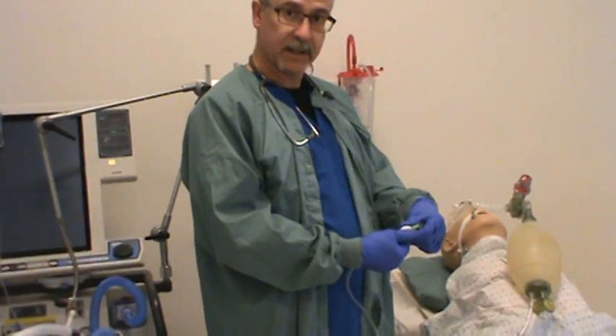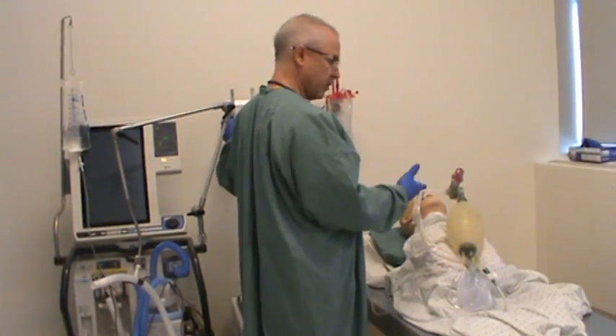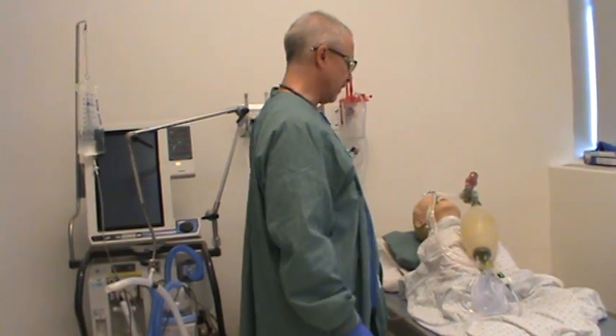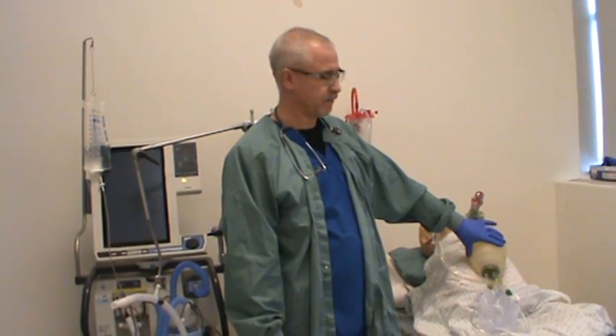We'll have that connected to our closed suction system and keep our suction locked until we need to use it — it's in the locked position right now. The next thing is to make sure my patient is running on 100% oxygen, which they should have been since I'm ventilating them. Now ideally you'd have a second person helping out, but for this video I'm going to simulate doing it by myself. Before you suction your patient, whether it's open or closed suction, you should assess your patient to determine if they in fact need to be suctioned.